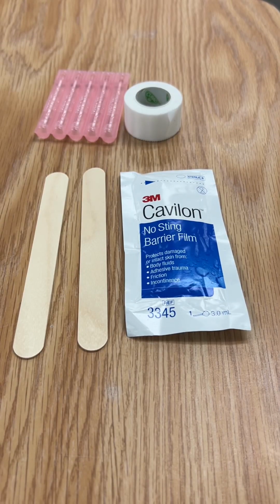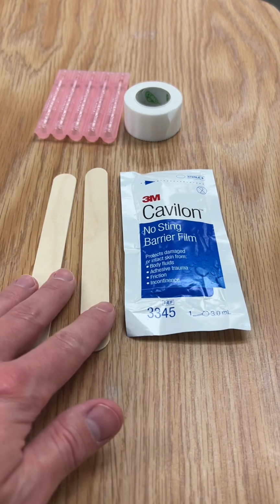Hey guys, let's talk about taping. As you know, we're going to have to start taping or tying more of our patients. So here's a couple of things you'll need to tape.